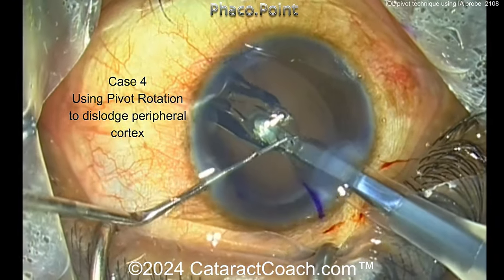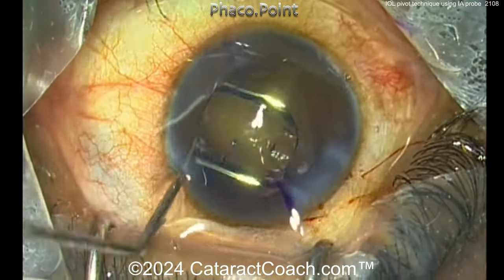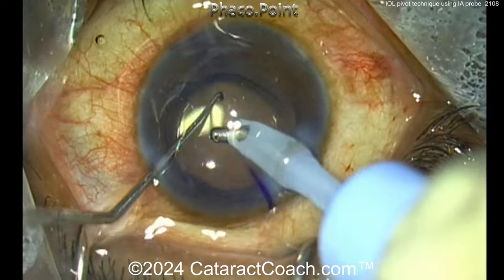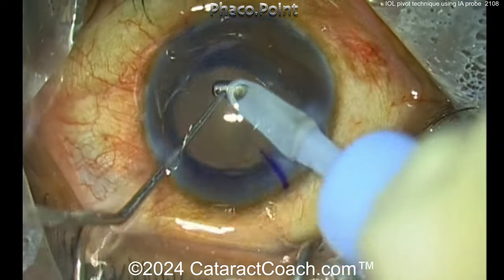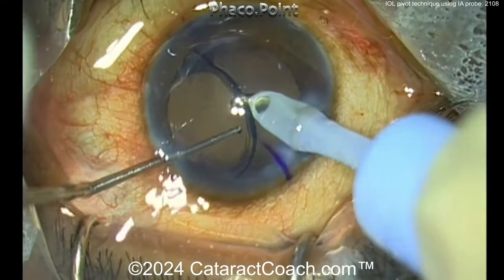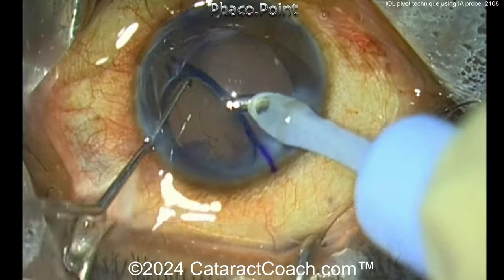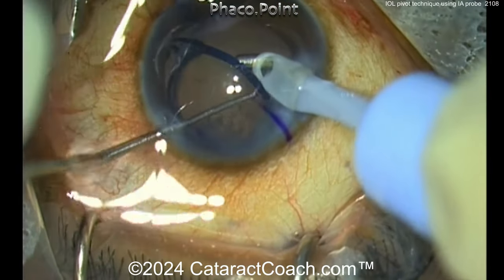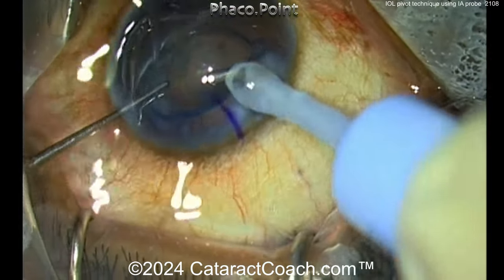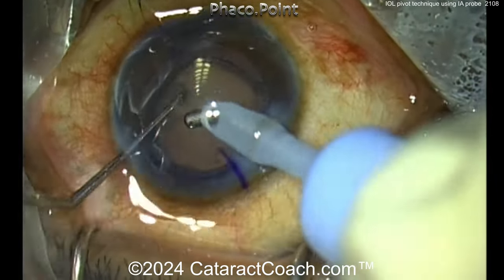Pivot rotation to dislodge peripheral cortex — let's see this one. These nicely done videos are from Phaco Point, Dr. Suvira Jain's channel on YouTube. Here, the pivot technique is used to loosen up sub-incisional cortex — using the optic to scrape against it and loosen it all up. That worked really well.